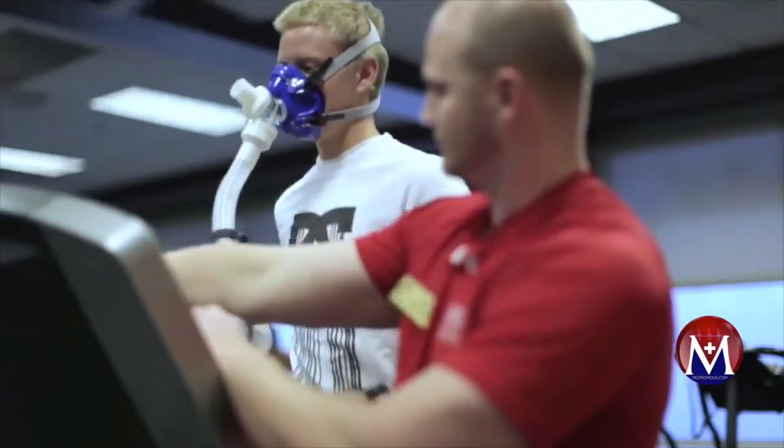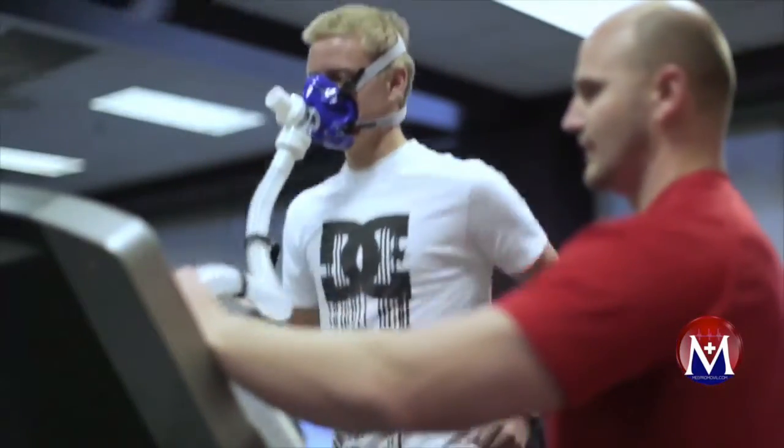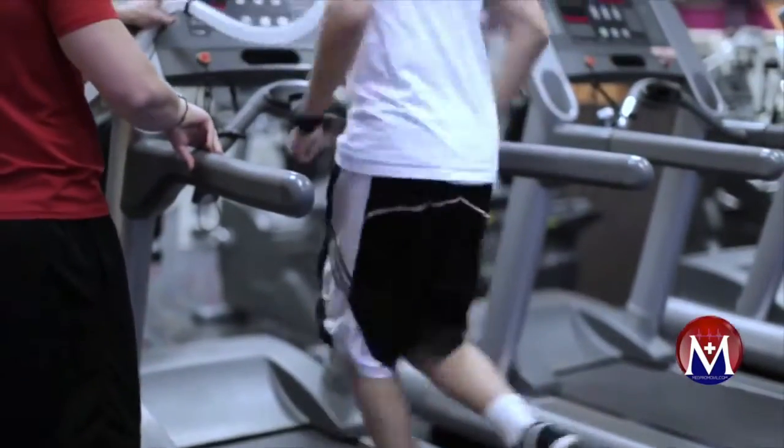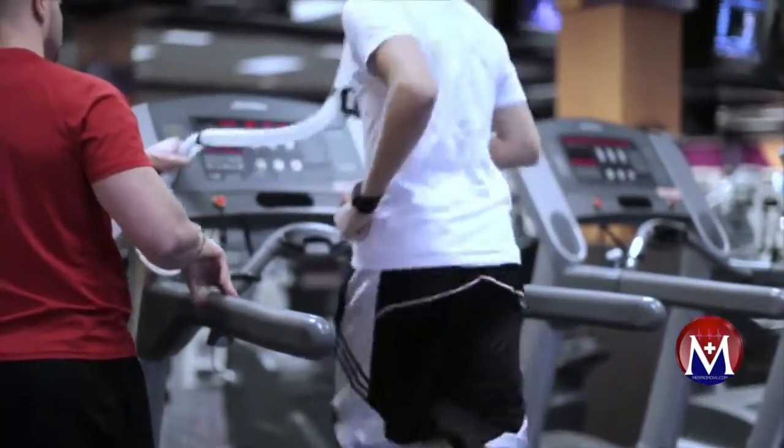It's very user-friendly. I mean, it's a lot of touch buttons. You can actually hook it up to your laptop and work off of that. And for the most part, all you have to do is hit start and it runs itself. There are other pieces of equipment out there, but just through my research and my own testing, this equipment seems to be the most reliable and the most valid. It's quick and easy, and that's what you're looking for as a trainer, something that's quick and easy and comfortable for the patient or athlete to use.